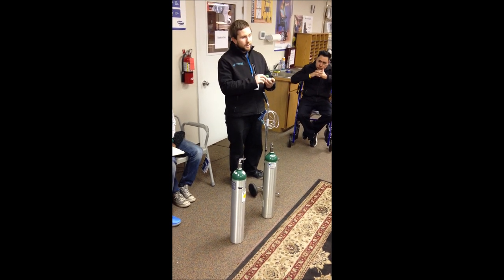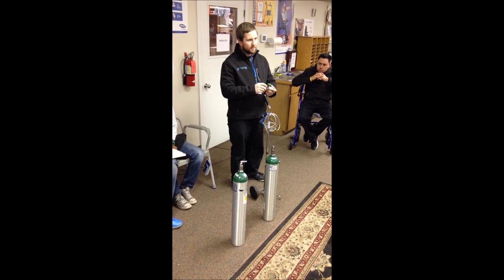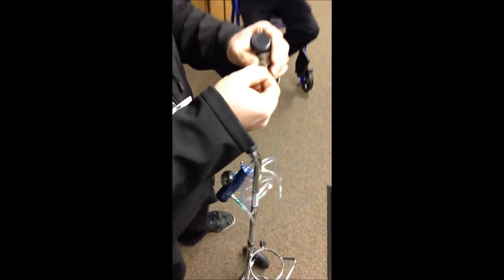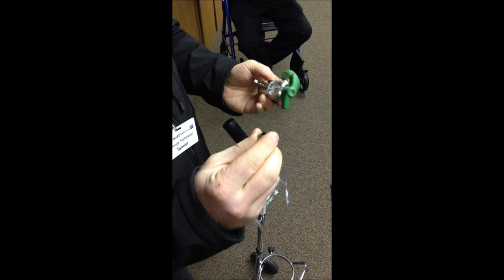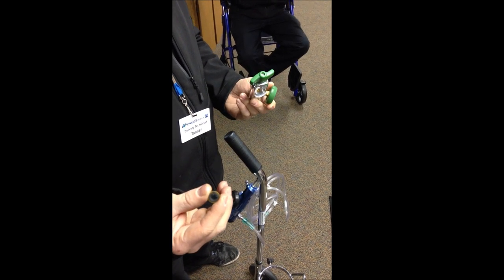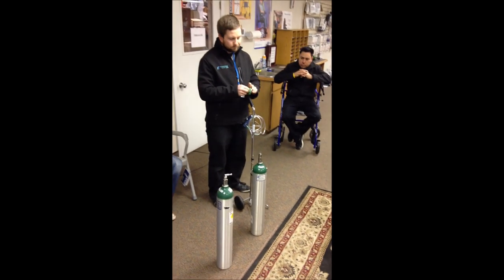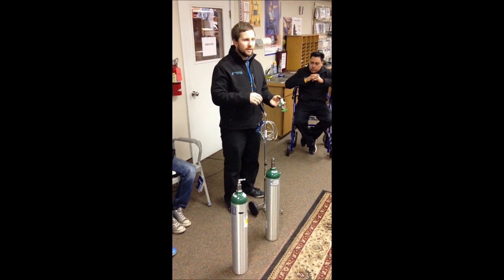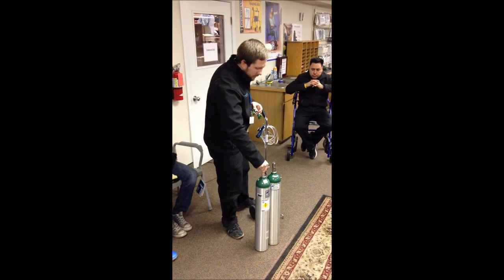When you turn on your regulator and you hear it hissing while it's set at zero, you want to find where that noise is coming from to figure out if there's a leak. There is a gasket here that does tend to wear out — this one I brought up is a little bit worn out. You can look at the gasket before you put the tank on. If it's worn out, it's going to hiss and won't have a good seal, letting out oxygen that isn't going to be used. We have replacement gaskets in the back and can replace them. The gasket can also get stuck to the tank when you take off the regulator, so you'd need to put on a new one — otherwise you'll have a lot of noise from your tank.